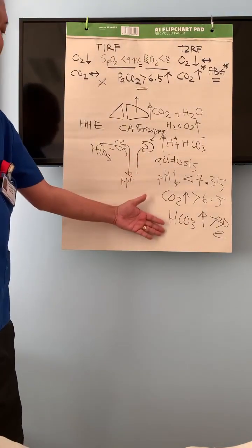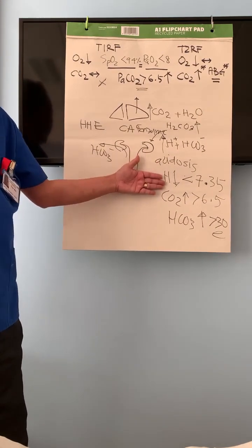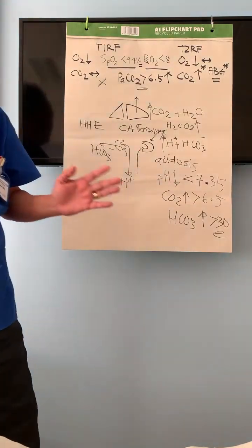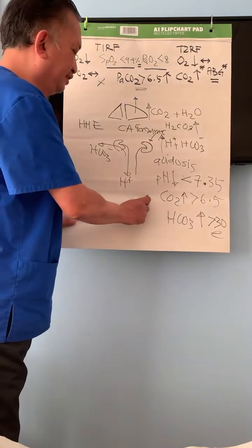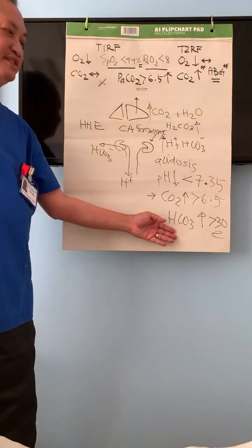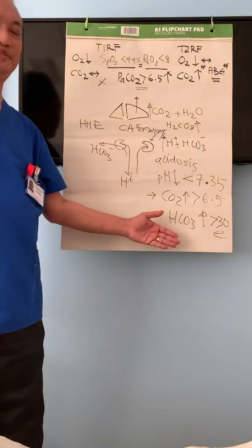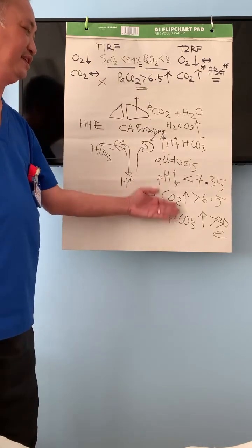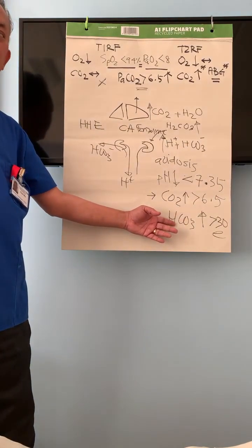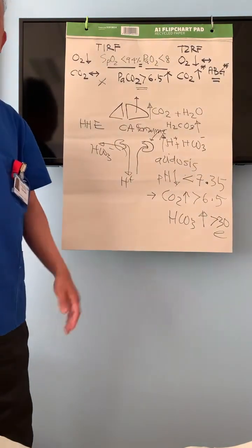So, how to interpret this acidosis. After seeing the acidosis, look at the pH first. This is acidosis. After that, we need to decide whether it is respiratory acidosis or metabolic acidosis. So look at the carbon dioxide second. If carbon dioxide is raised, this is respiratory acidosis. And look at the bicarbonate as the third step. If bicarbonate is low, yes, this is metabolic acidosis. But high bicarbonate means this respiratory acidosis has been compensated by saving the bicarbonate. So this is respiratory acidosis, compensated.